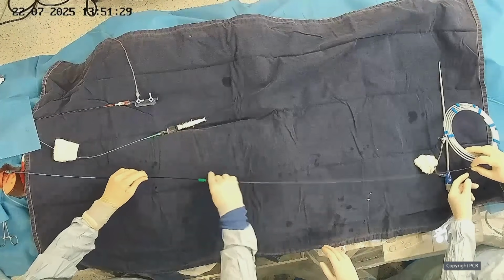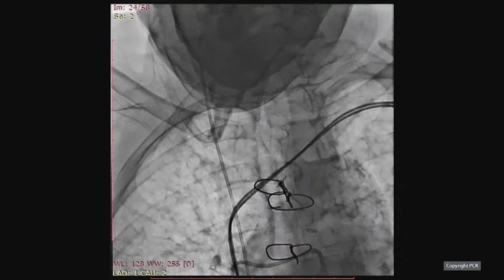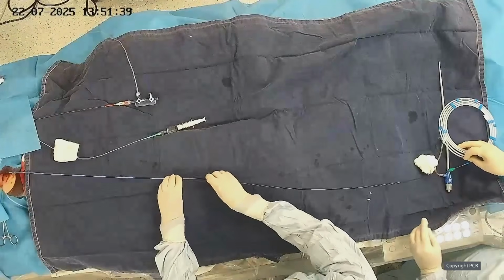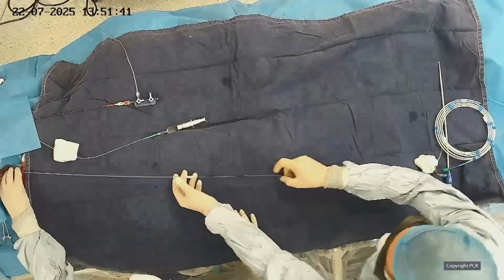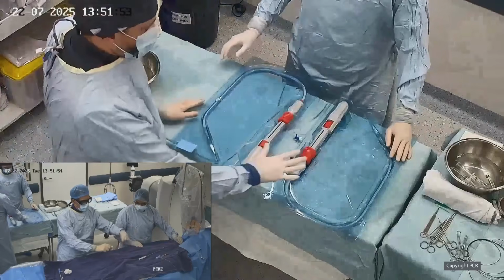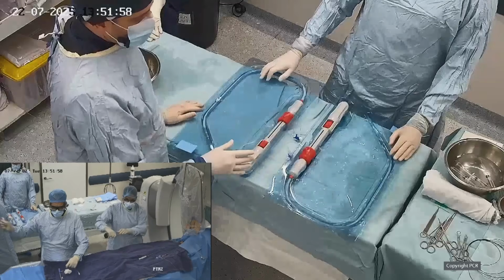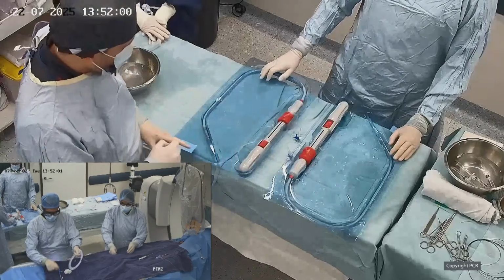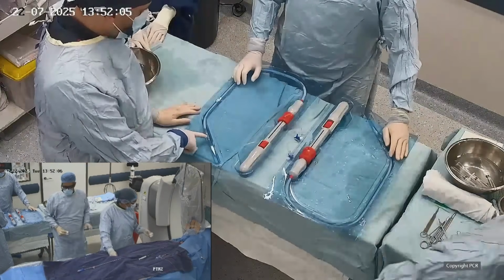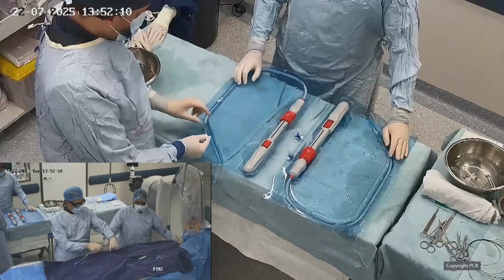While removing the catheter, I'm going to show you the first system that we are going to use. Please come here with the camera. We have two systems, superior and inferior. You can see that both are very similar. They are 28 French in size, and you have a very flexible nose cone, then the capsule that contains the valve, and the system.